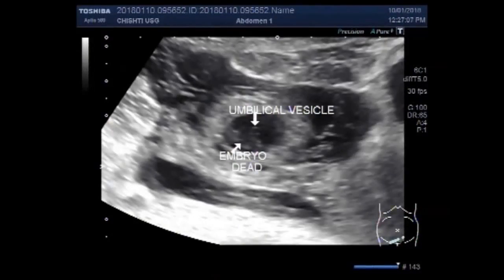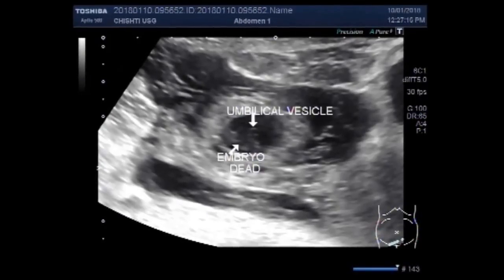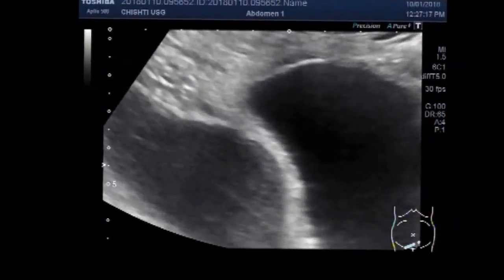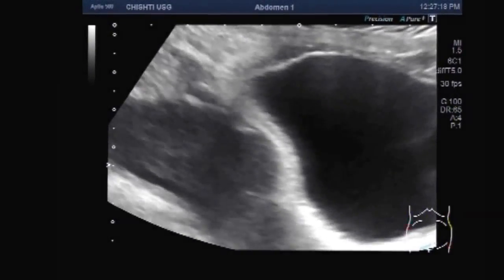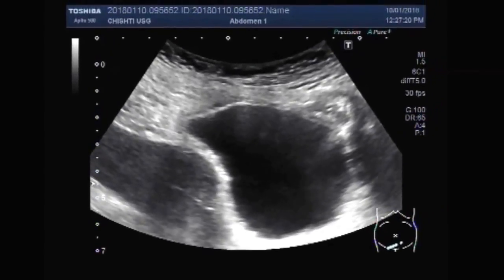Dear viewers, I hope you are all fine. This ultrasound video shows an extra-uterine pregnancy with a dead embryo — an ovarian pregnancy.